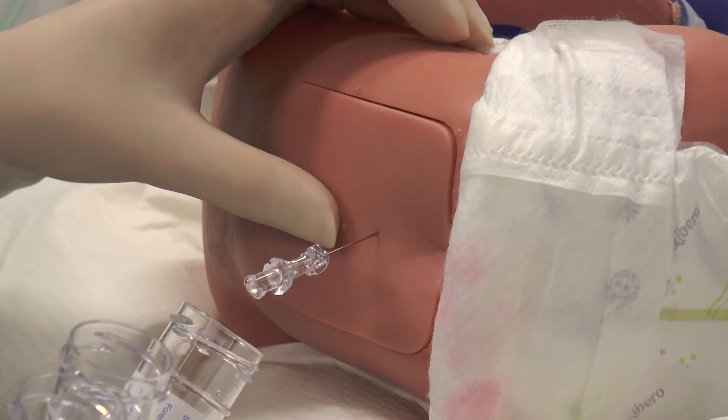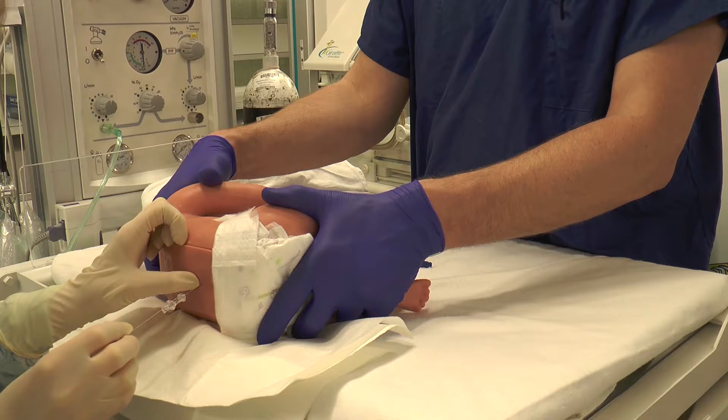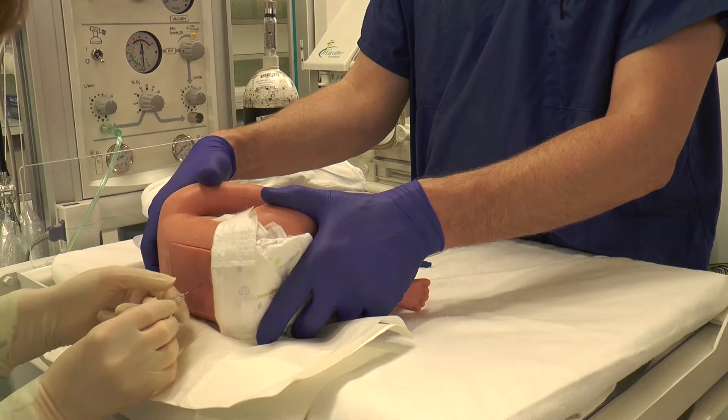If CSF is not flowing, consider rotating the needle to face the bevel towards the head, massaging the fontanelle, or slowly advance or withdraw the needle depending upon the position. If the needle position needs to be adjusted, please replace the stylet each time.